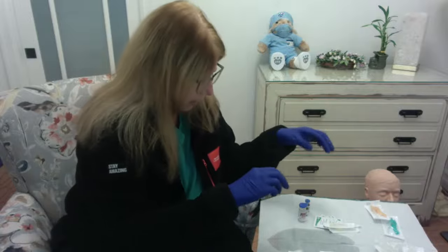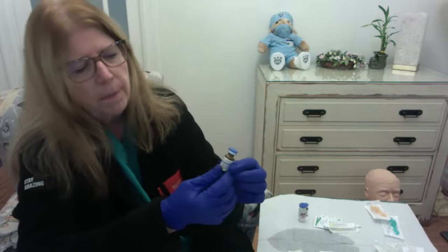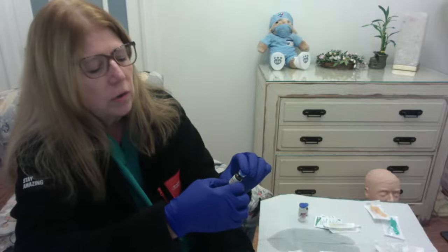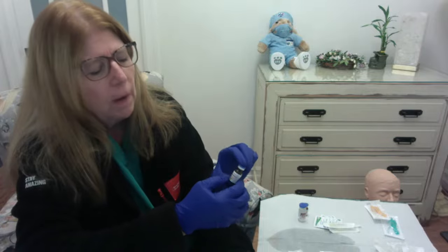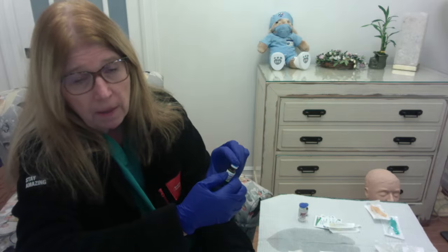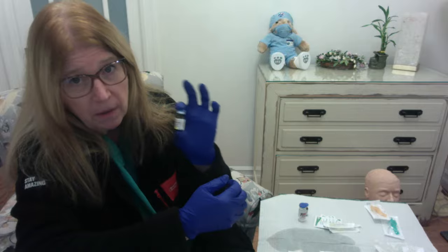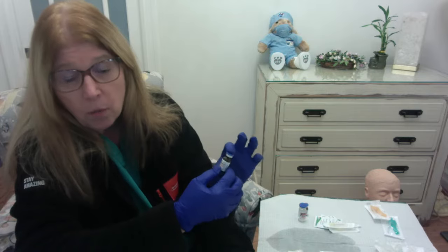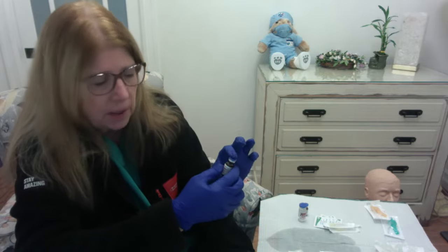Okay, so let's open up both of them, and then I'll show you some other things related to, of course, taking the medication out. So let's start with the small vial, okay? So first of all, it gives me the name of the medicine. It gives me a concentration. It says that there is 50 milligrams per milliliter, and this is a 2 milliliter vial. So what does that mean? That means that there is a total of 100 milligrams in this vial, right? So if I have to give 50, I'm going to give 1 milliliter. If I have to give 25, I'm going to give a half a milliliter.